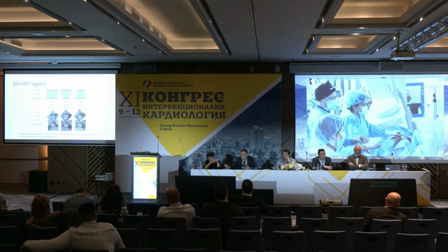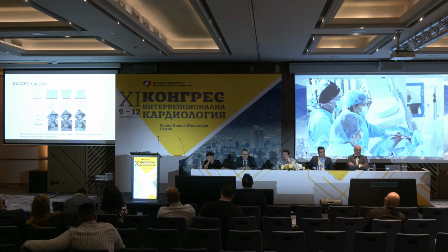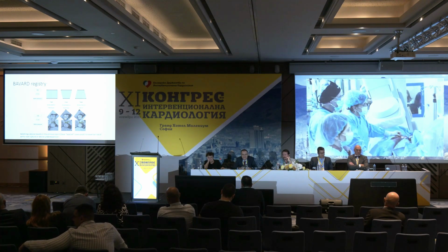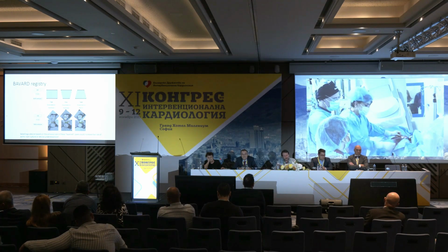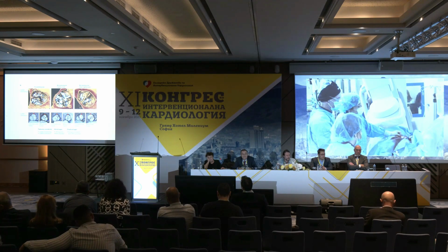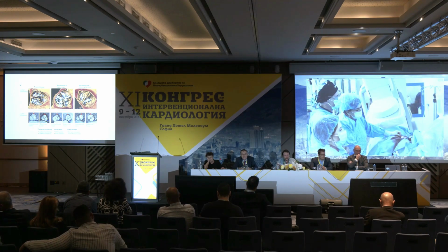separate the patients into 3 groups: tube when the size of the annulus and the ICD is the same, flare when the annulus is smaller than the ICD, and tapered when the annulus is higher than the ICD. Our patient's size is close to flare, but the difference between the ICD and the annulus is 0.6 millimeters. It's not that much, but still the size is in the 34 range of the valve.